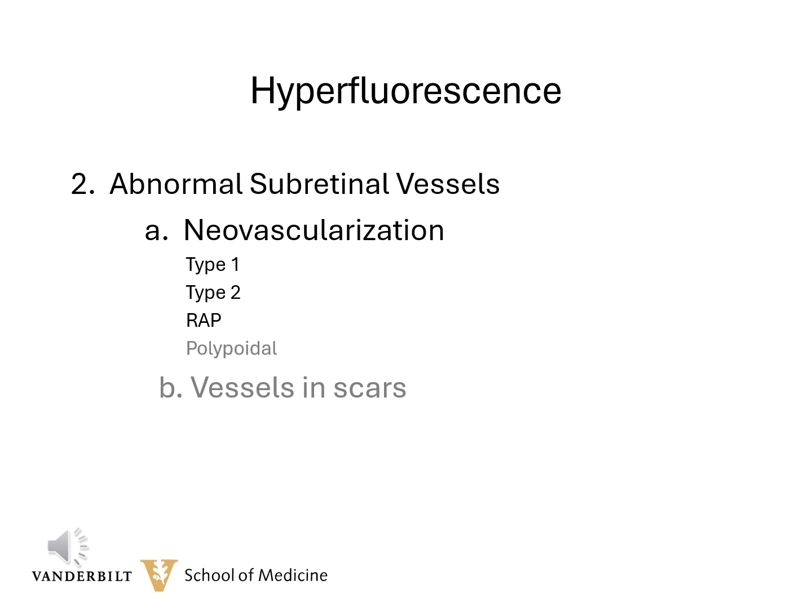Now, although subretinal neovascularization can be divided into 4 types, in reality, retinal angiomatous proliferans is intraretinal and not pure subretinal, but it is listed here because it is a subgroup of age-related macular degeneration. Now, in age-related macular degeneration, there's type 1 and type 2. An older term for type 1 was occult and type 2 was classic, and this was an angiographic definition.